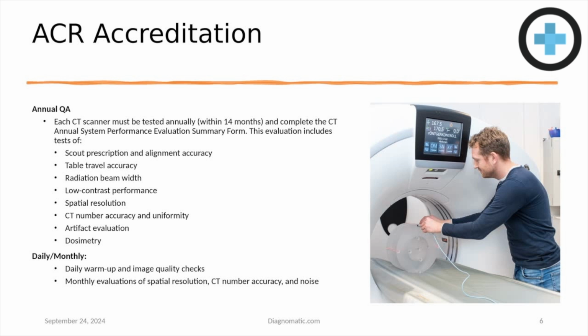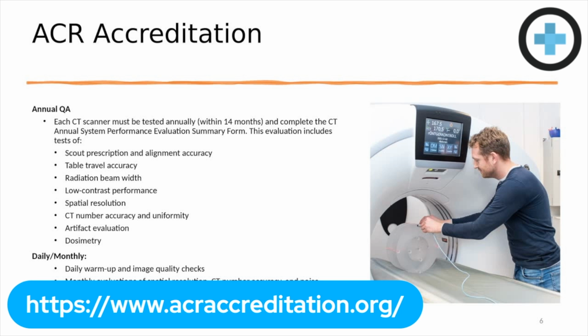As far as record keeping and documentation, a really good resource is the acraccreditation.org page that has links and PDFs of every modality that falls under the ACR accreditation program, but also gives you all your paperwork for, again, the record keeping side, as well as test taking techniques. So it's a really good resource. It even points you in the right direction of where to buy an ACR accredited Phantom.